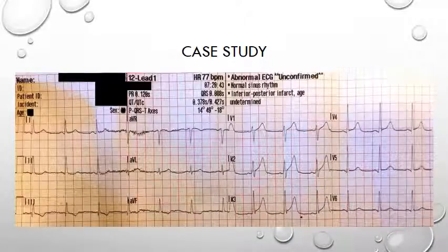Going back to the ST depression and T wave inversion in the inferior leads: since ischaemia doesn't localise, this finding is most likely reciprocal ST depression to the anterior leads. We can also see some ST elevation in V2 to V4, which wasn't covered earlier and is now being highlighted.